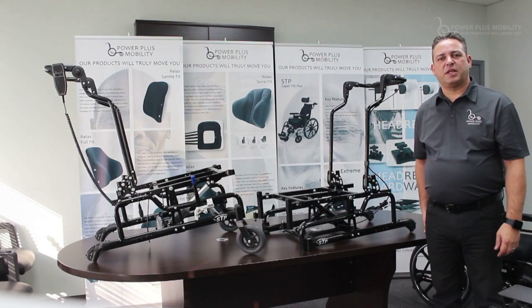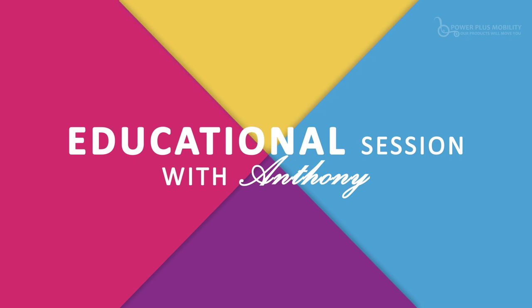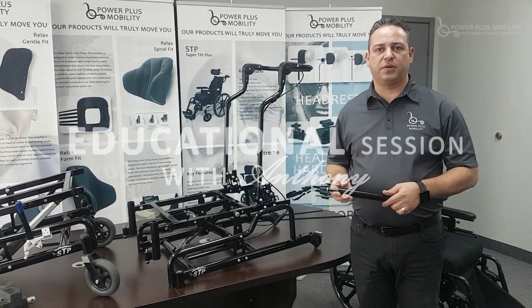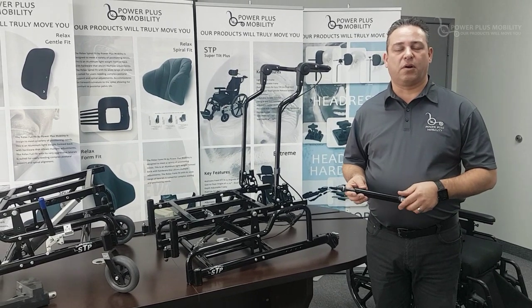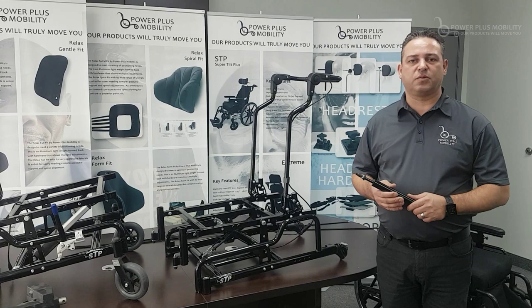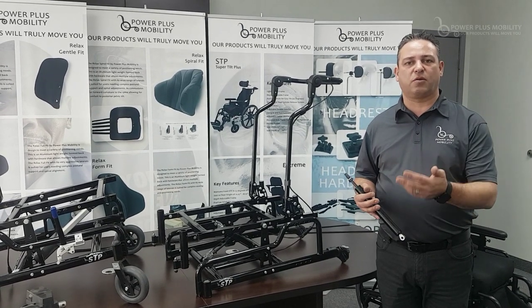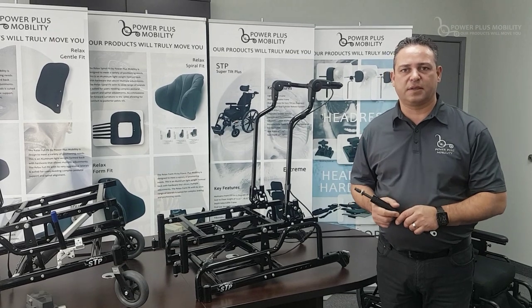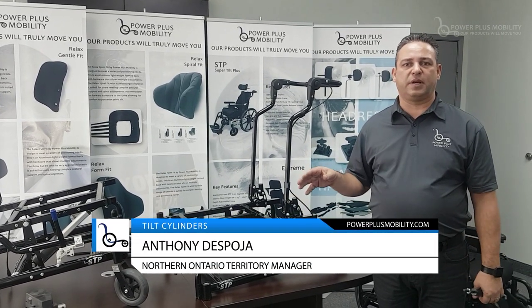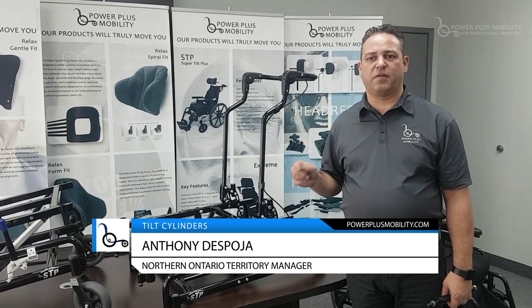Welcome to Power Plus Mobility's educational session. Today we'll be talking about the various cylinders that we use on our tilt chairs. There are different types of weight capacities on chairs, and we switch out the cylinders depending on the weight of the client or where the center of gravity is positioned. Our standard tilt cylinders used on our STP and Extreme are 200 pounds and 500 pounds.